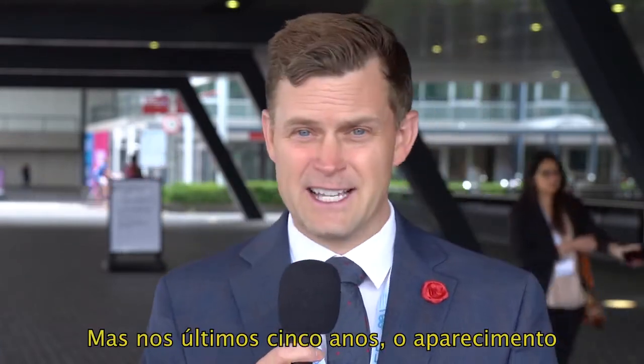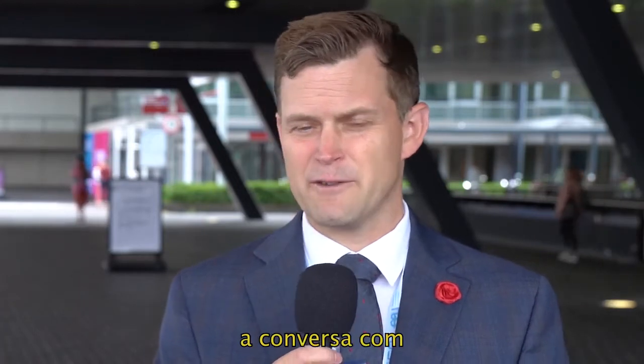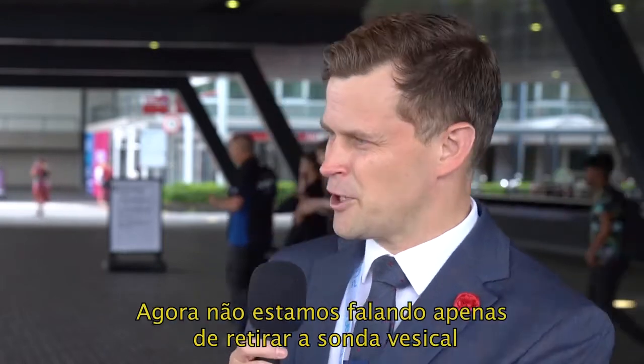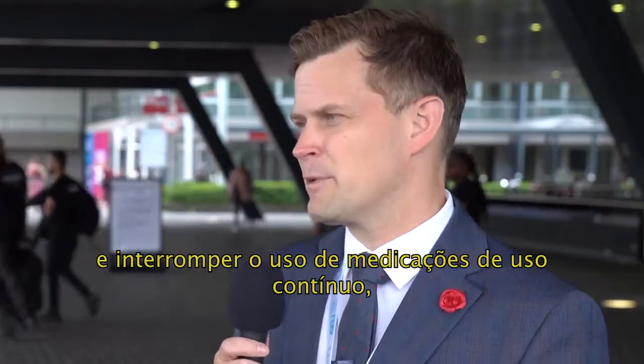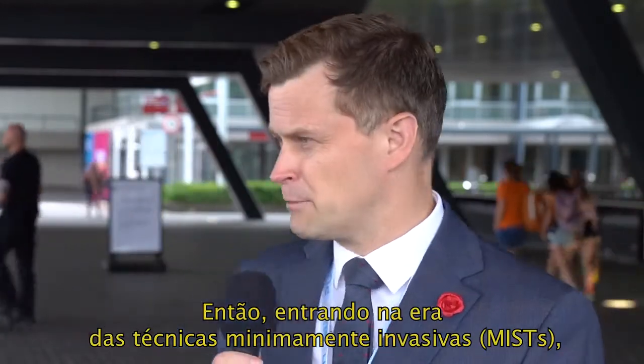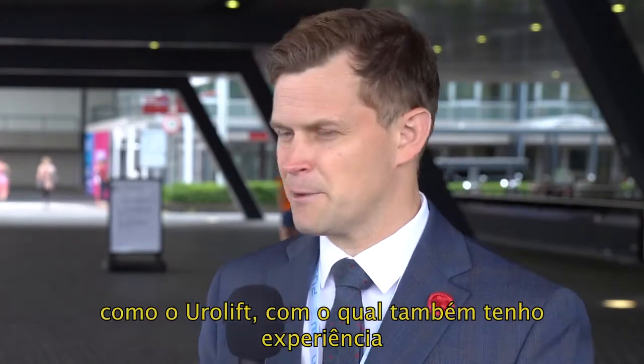But in the last 5 years, the explosion of different technologies for BPH has made it a little bit more difficult in our conversations with patients. So not only are we trying to get the catheter out and getting them off meds, but now we have to talk about ejaculation and sexual function and durability. So enter the era of minimally invasive techniques and UroLift, which I've had some experience with as well.